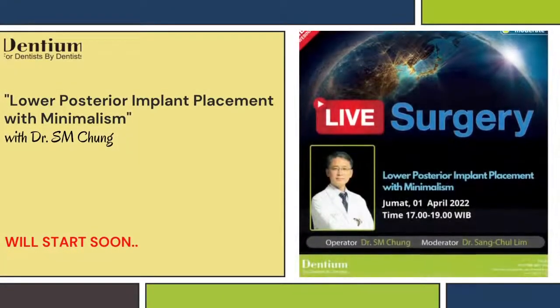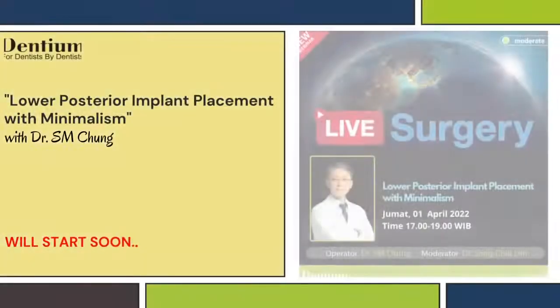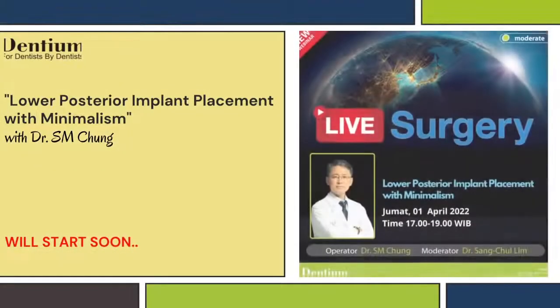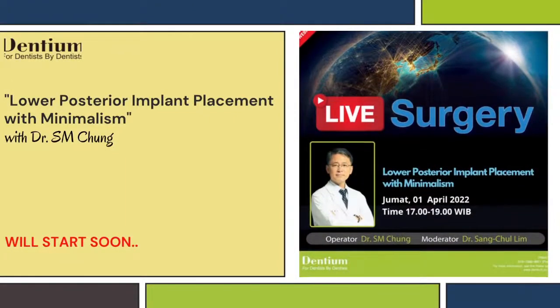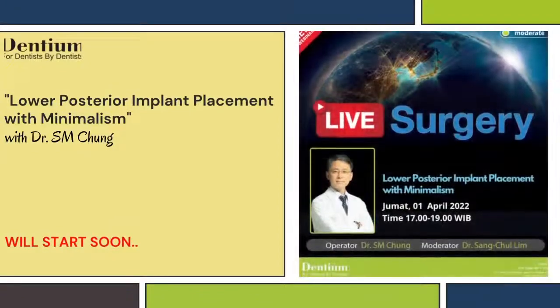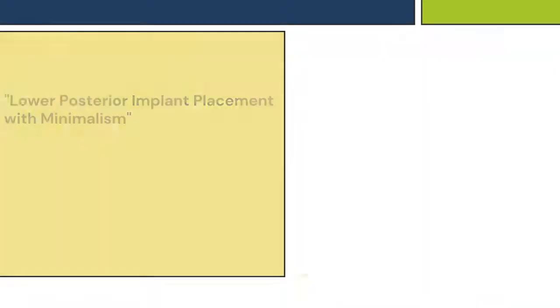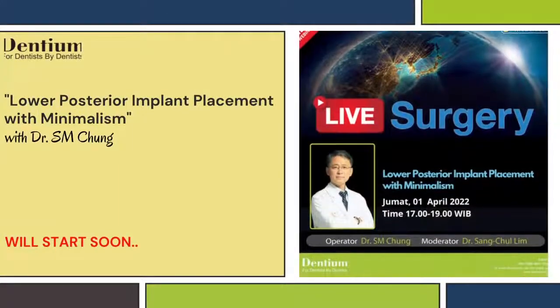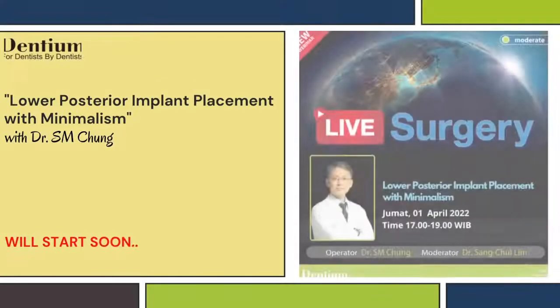Today's case, as I mentioned already, is lower posterior implant placement with minimalism. As you can see, it is a panoramic view of our patient: an upper fully edentulous area and a lower partially edentulous area. And this one is a CT scan.